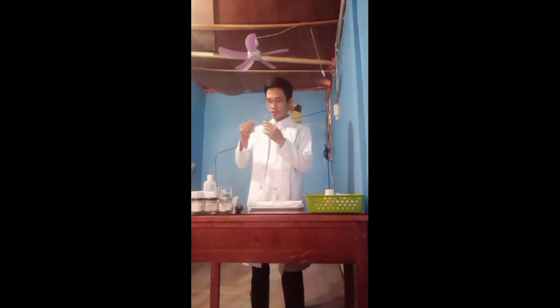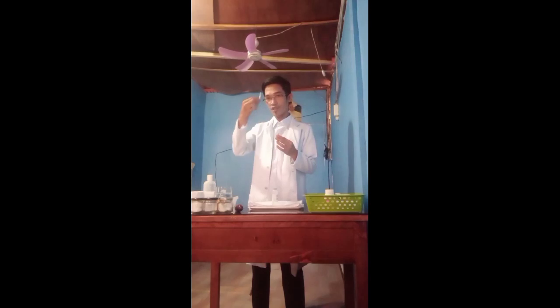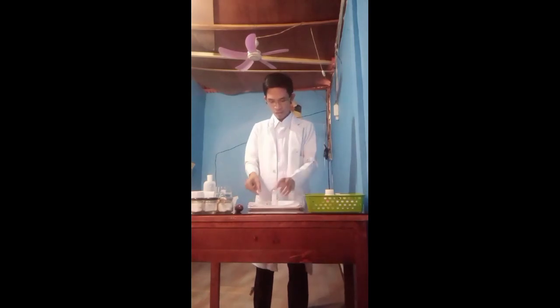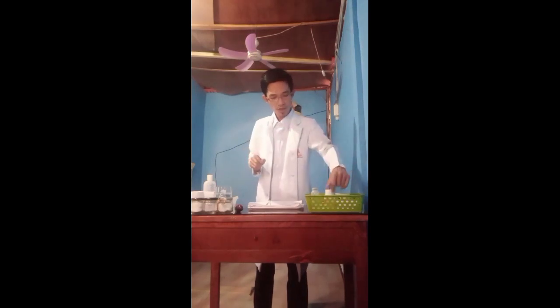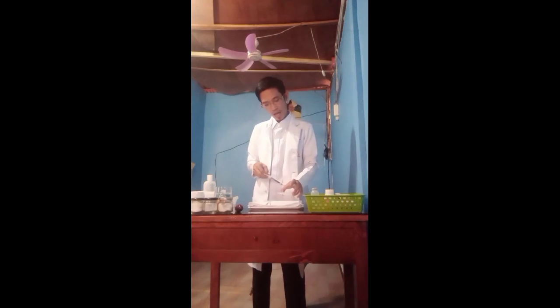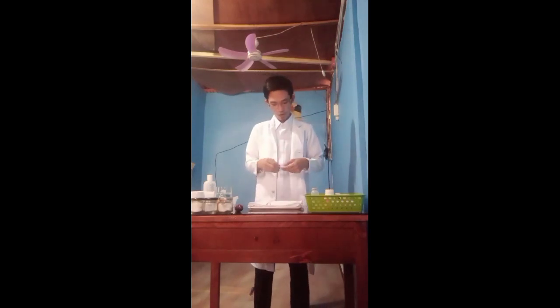So now change the needle to the needle that you're going to use for injecting. You put it in the waste receptacles. So now going back to the normal syringe. The remaining you need to keep in the basket. Okay. So next is the ranitidine, which is 50 milligram or 0.5.